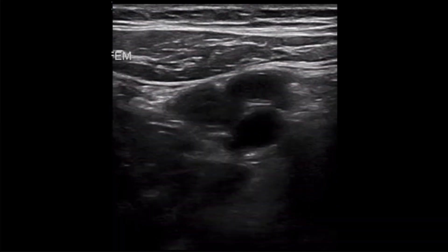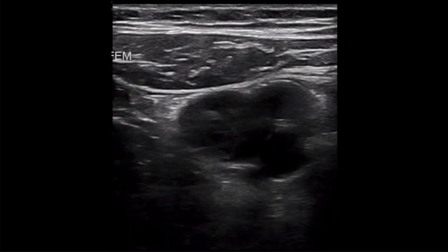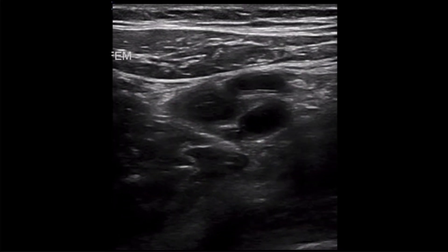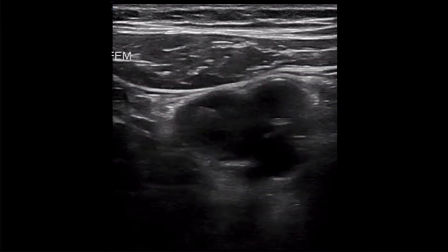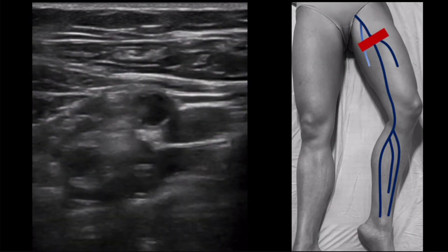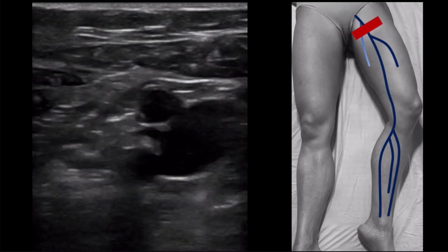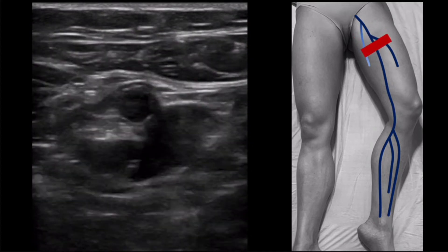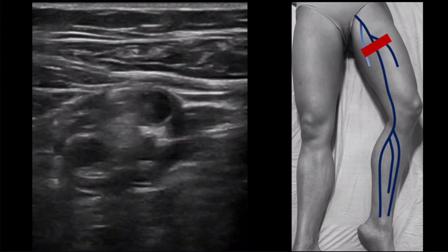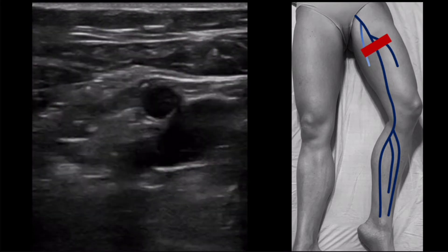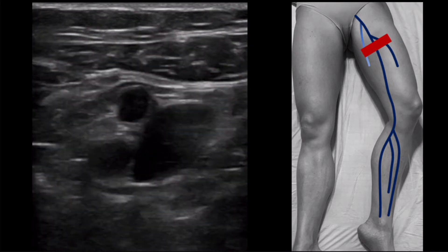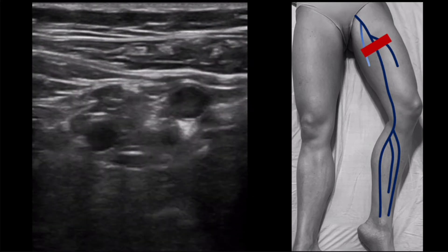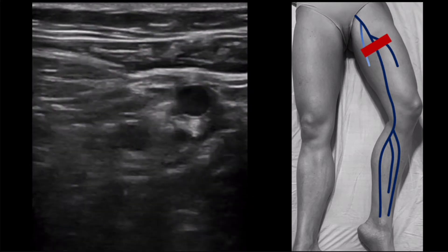This example shows another DVT in the common femoral vein, just distal to the junction of the greater saphenous. Again, the vein is not compressible and there is echogenic material within the lumen. Starting at the junction of the greater saphenous with the common femoral, I now gradually work my way down while compressing every few centimeters to where the common femoral becomes the femoral vein and deep femoral vein. In this clip, we can see this transition as the operator slides the probe distally and then compresses at that junction to make sure there is compression at the branch point.